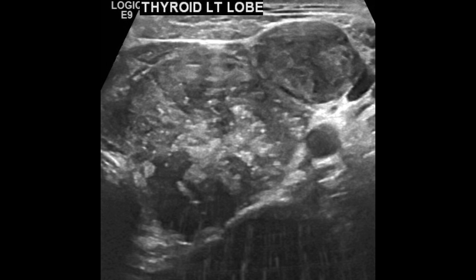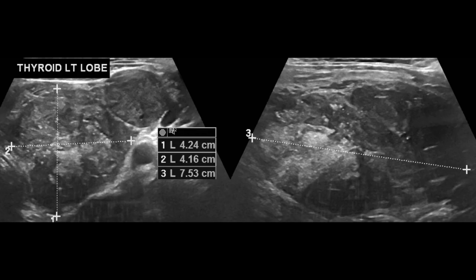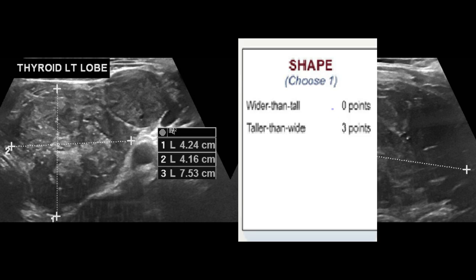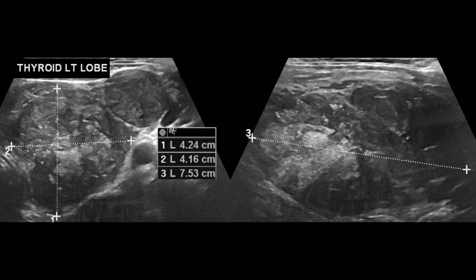Now we move to the shape. We can tell from this image that this nodule is taller than wider. When we measure the AP diameter and compare it with the width, the AP diameter was greater at 4.2, so we will give it three points as it is taller than wide.